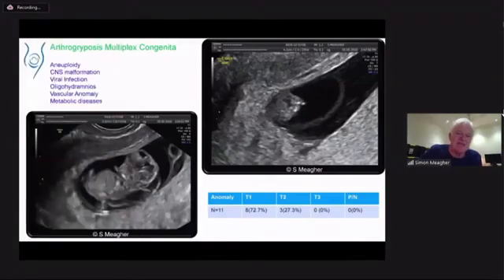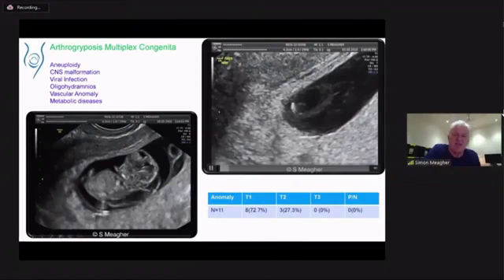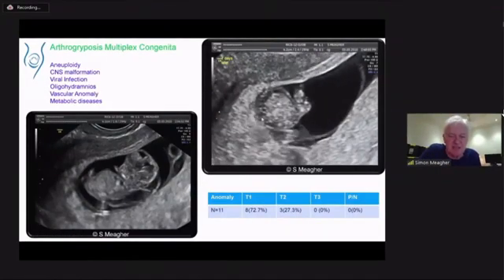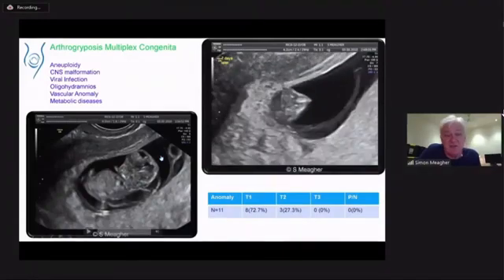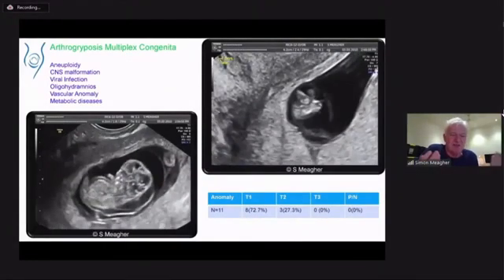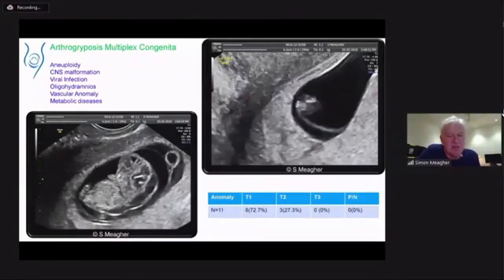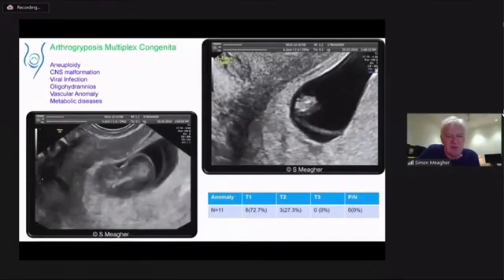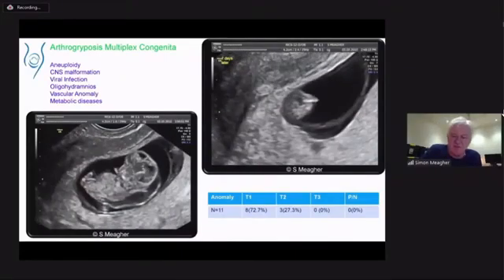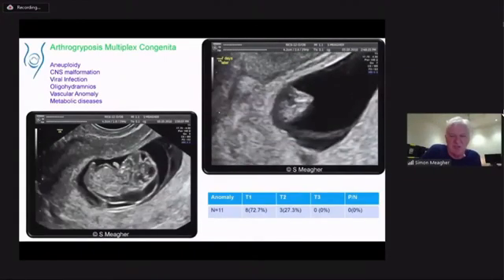And then there's the akinesia syndromes. And for these, it's just a fetus with fixed flexion deformity in unusual position. So this is a fetus in a Buddha position with the legs that simply didn't move. And in fact, the fetus didn't move at all for the entire duration of the scan. There were fixed flexion deformity of the hand, subcutaneous edema, increased nuchal translucency, which are all features described in arthrogryposis multiplex. This was in a fetus at 10 weeks of gestation.